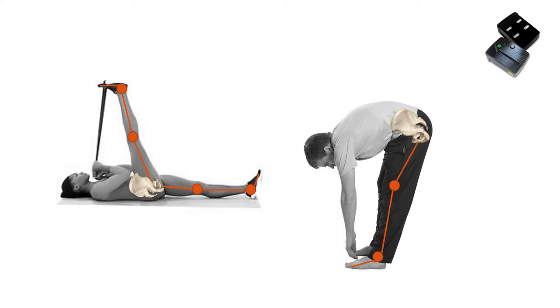You can do that with a band, or alternatively by lying down in a doorway with the heel of one foot placed up against the doorway and the other in contact with the ground. And again, just a nice example here of helping us understand muscle activity and its applications.